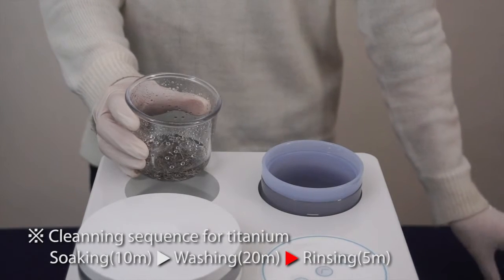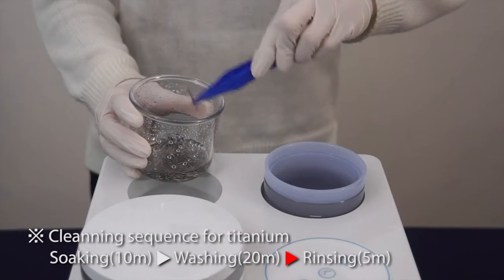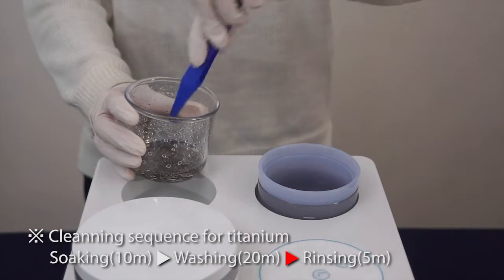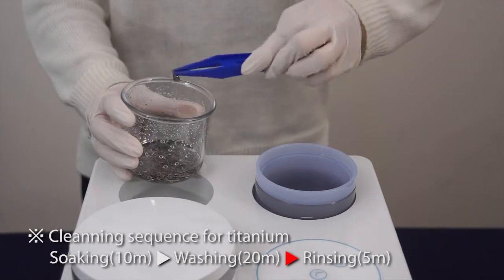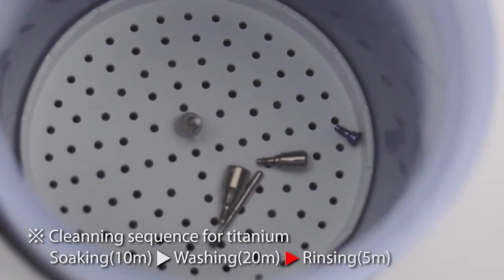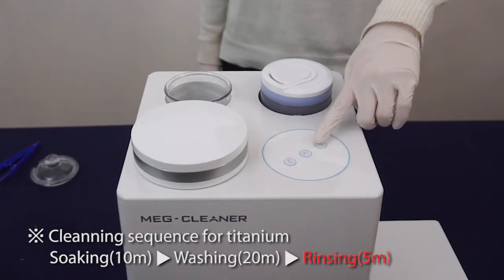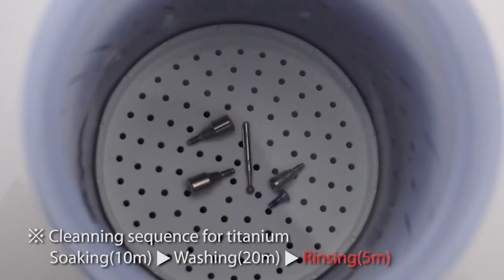When picking up the object from the washing jar, use plastic tweezers to easily remove the barrel chips and gently dust off two to three times to remove barrel chips. Then move the object to the rinsing jar. Turn the rinsing switch on and wait for the auto beep and power off after five minutes.